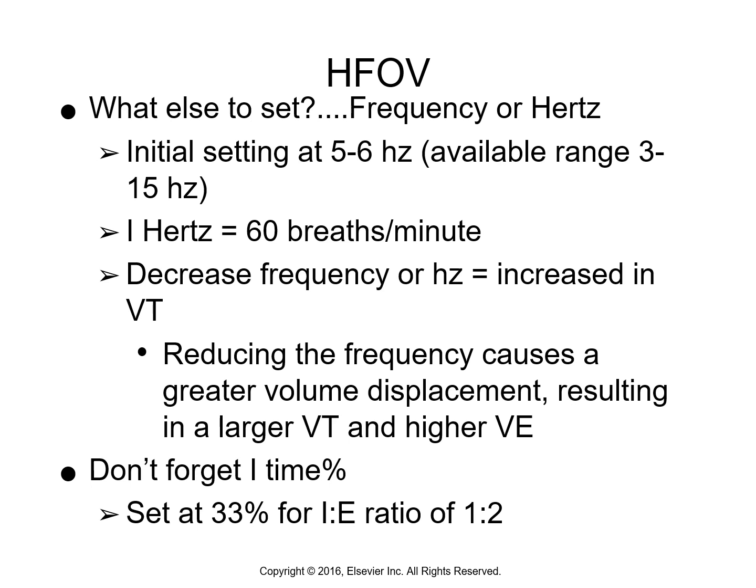So believe it or not, when you want to increase your tidal volume, or increase your minute volume, you are actually going to reduce the frequency, because that slows the movement of the piston down a little bit, but it causes a greater volume displacement. So it's reducing the frequency of the piston, not so much the strength of it, but the frequency of it, and it causes a greater volume displacement. Okay.